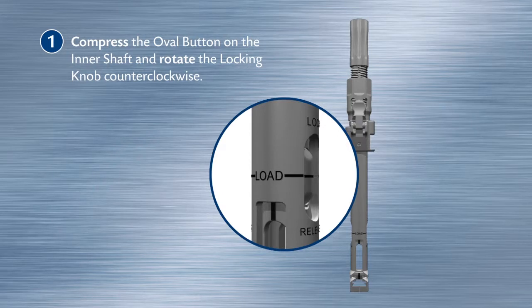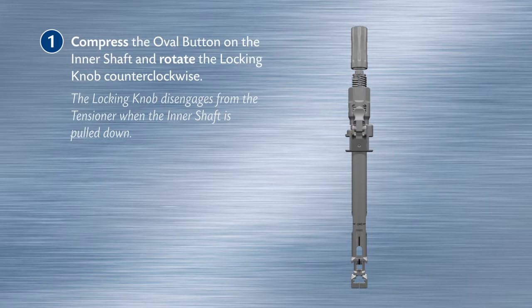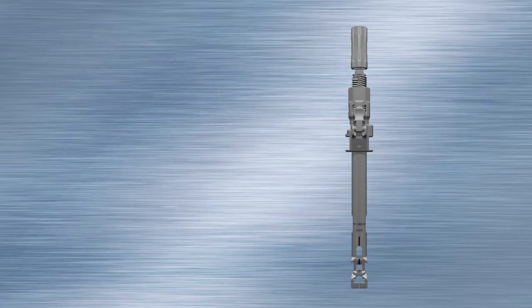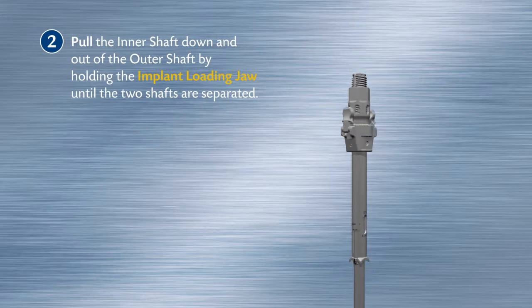The locking knob disengages from the tensioner when the inner shaft is pulled down. Pull the inner shaft down and out of the outer shaft by holding the implant loading jaw until the two shafts are separated.